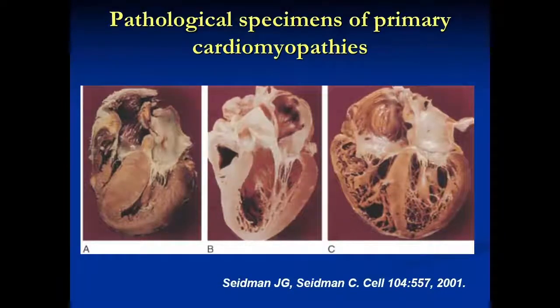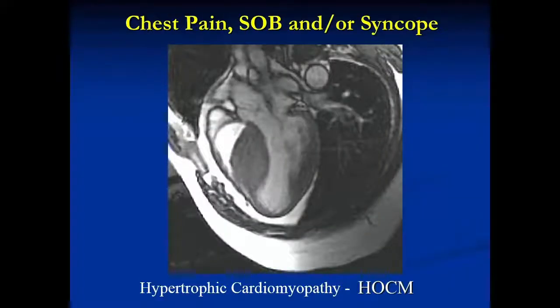Back to, we talked about the dilated paradigm. Let's talk about the hypertrophic paradigm. This has been really a very important experience for cardiac MR because in these patients, cardiac MR is fundamental. So if I can have the next slide, please.